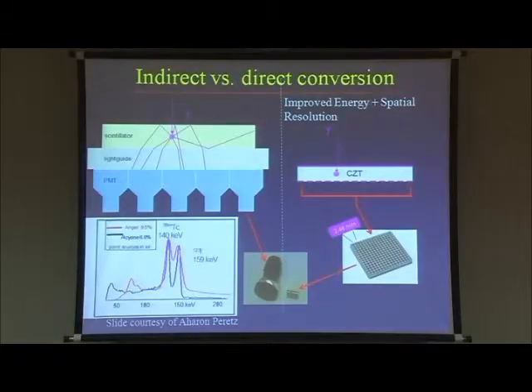So you need to start thinking a little differently, and what you're going to see is that everything works synergistically to make the images not only look better, but be more accurate from the concentration point of view. Because one of the strengths of nuclear cardiology is that our pixel values are linearly proportional to the radionuclide concentration, which in perfusion is also proportional to blood flow.